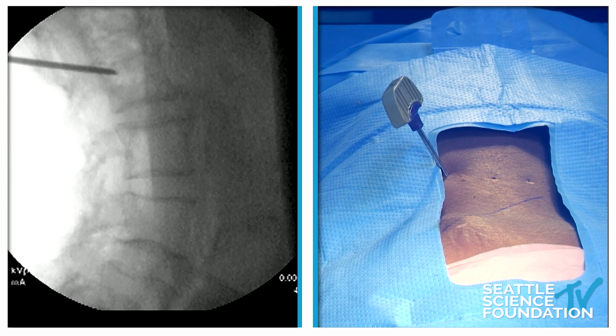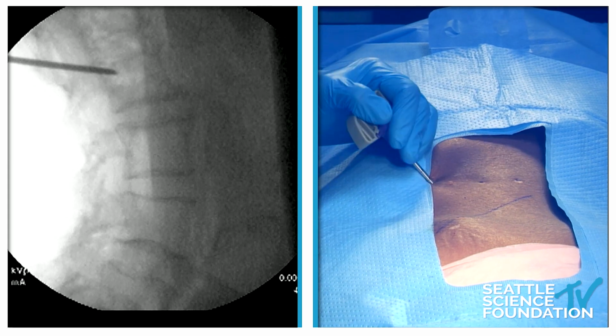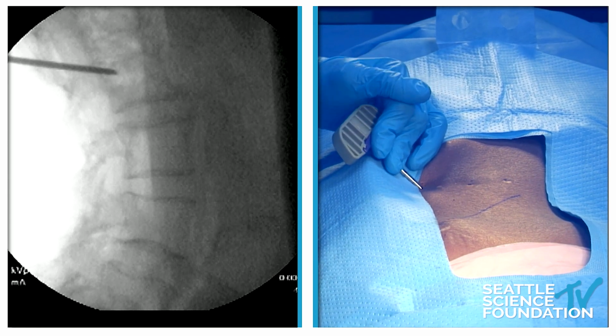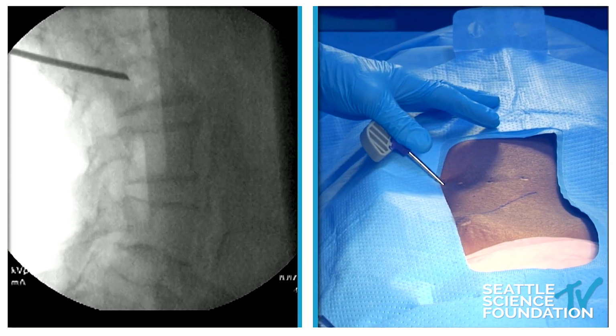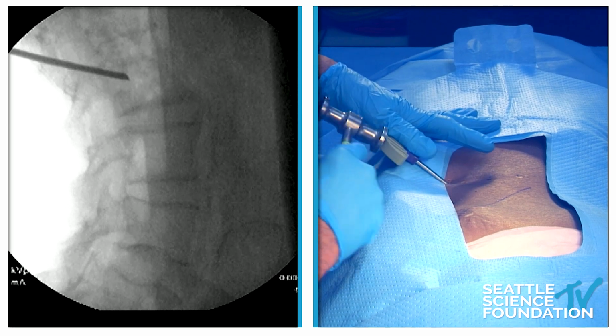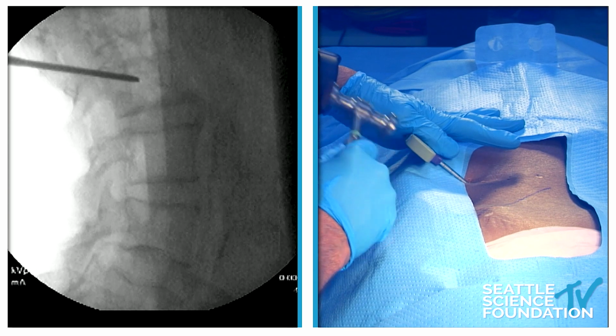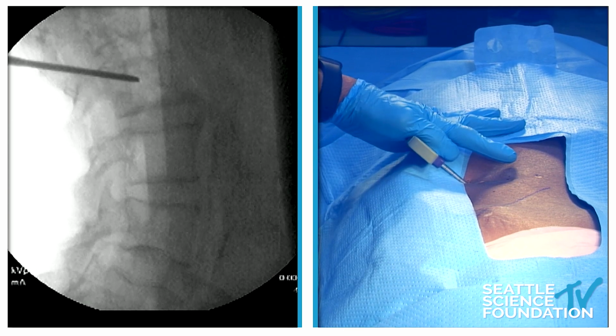So we're already in the vertebral body, and to medialize that, I'm going to use the directional capability of this needle and drive it more toward the center of the vertebral body. And we're getting toward the center.